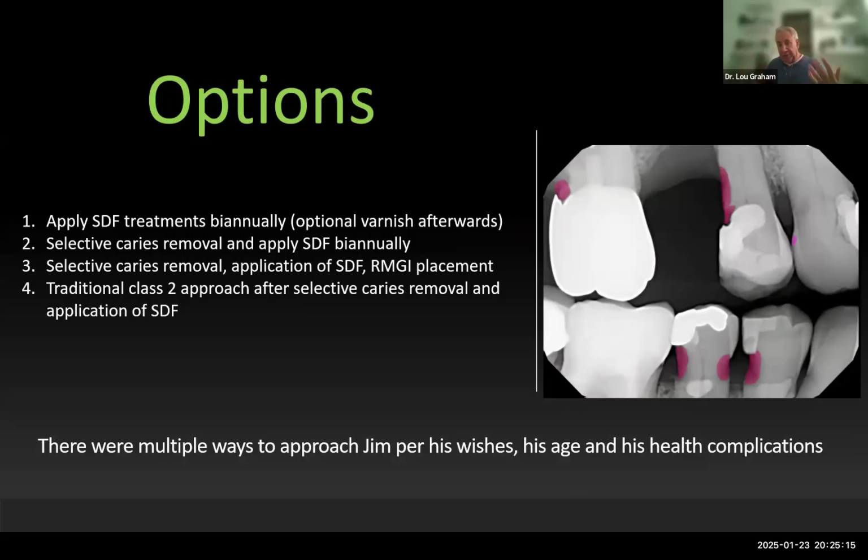And what I would do is then I would just take out the amalgam. The other one was a composite. Just take them out. Do selective caries like I'd shown you today. You can leave caries. Probably do this without any anesthetic. Apply the SDF first after the drilling. And then place your composite or glass ionomer and composite, however you want to do your class 2s. But these are the approaches for everyday dentistry as I look at it.